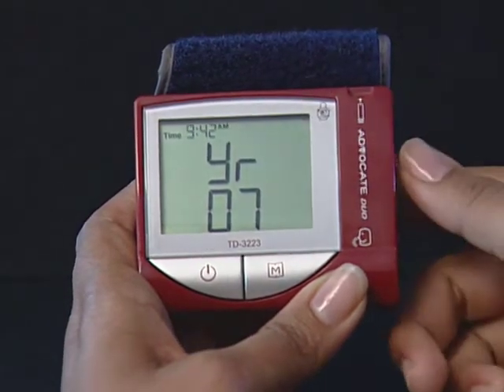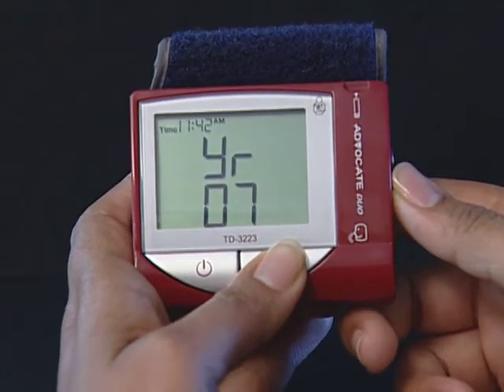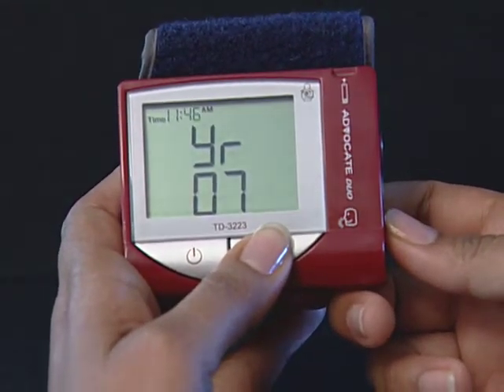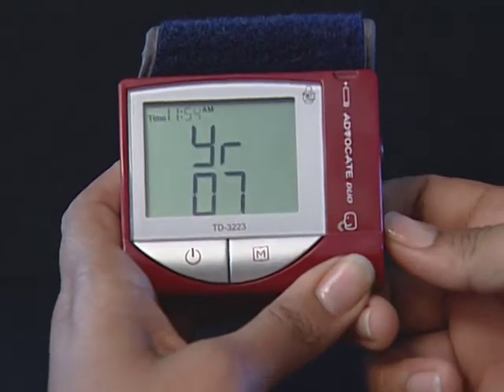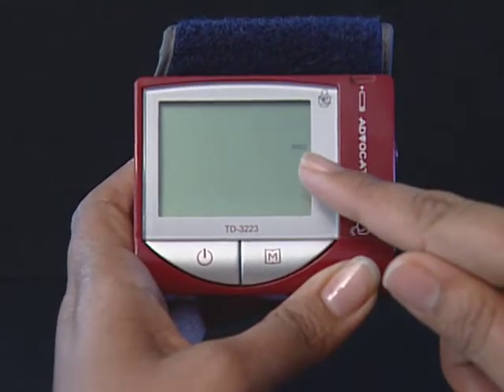Step 4: Set the hour. Press and release the M button to advance one hour. To move faster, hold the M button down. With the correct hour on the display, press the set button and then the minute segment starts flashing. Set the minutes. Press and release the M button to advance one minute. To move faster, hold the M button down. With the correct minute on the display, press the set button and then the current unit of measurement starts flashing.